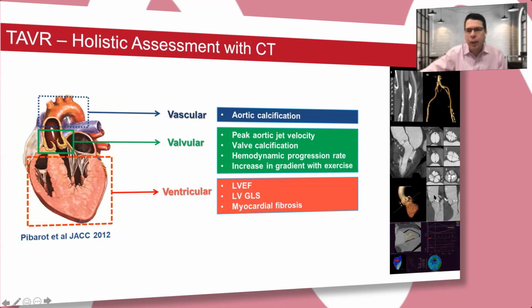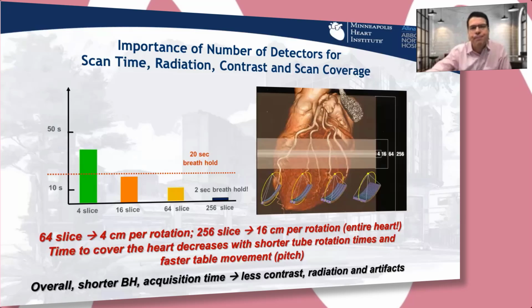We can look at the measurement of the coronary ostial height, angles of implantation, but more recently too, the development of myocardial strain with the functional evaluation of these patients has provided us some important insights into the patient's myocardial characterization as well as the myocardial function analysis.